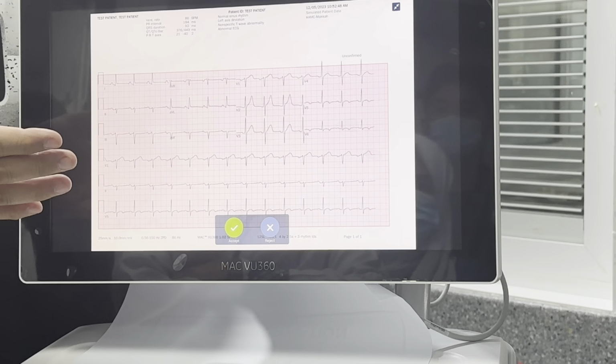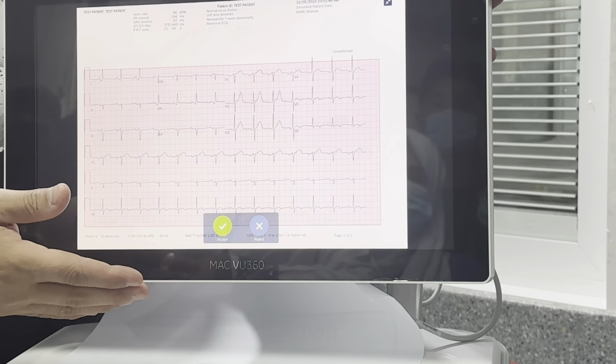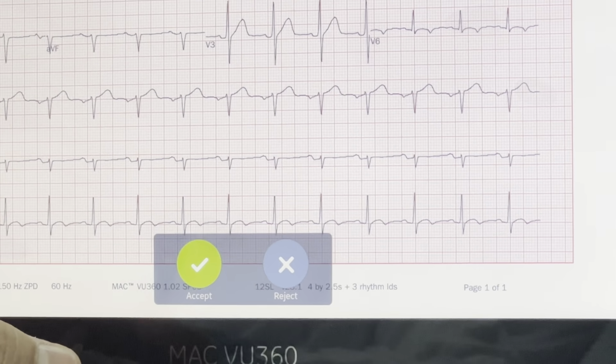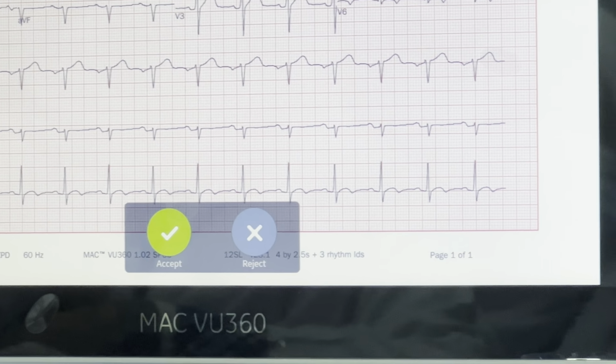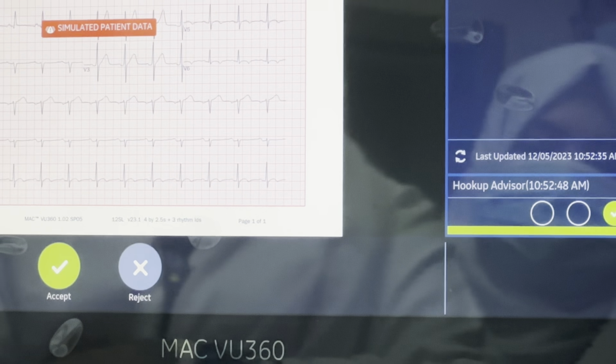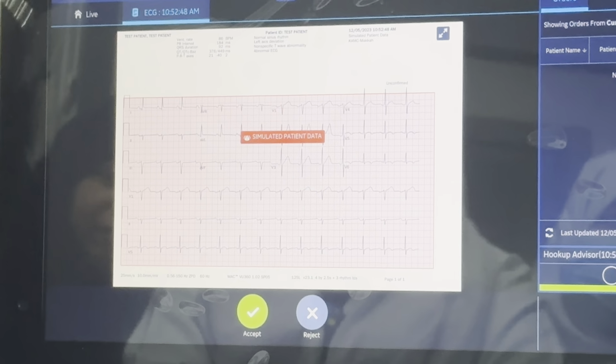So now it will leave the decision for you to decide. So what are the options I have in here? Accept, reject, cancel, and minimize. Minimize. So why do I really need to minimize? Remember we said that we have one order, one report. We don't have to do the duplicate anymore.